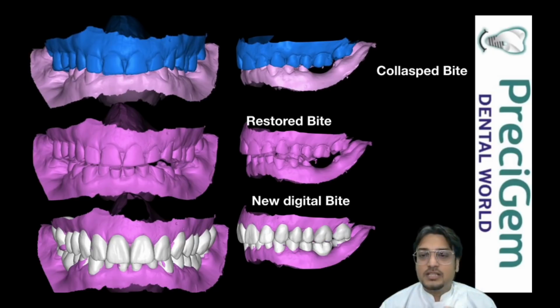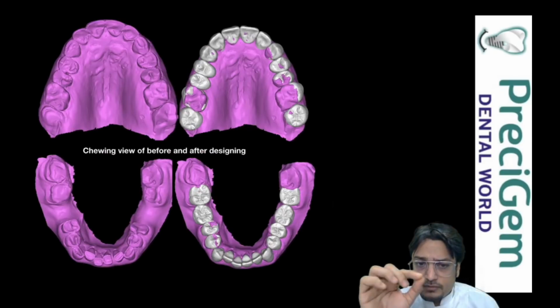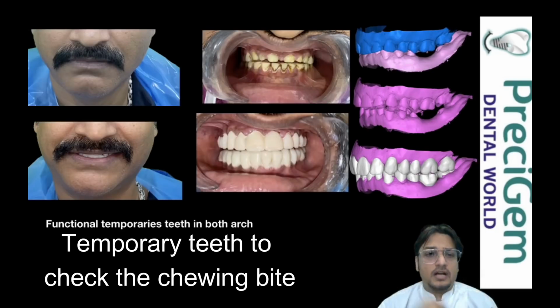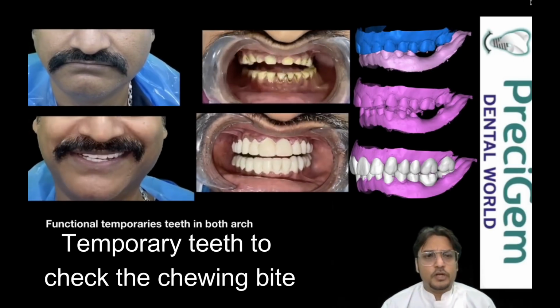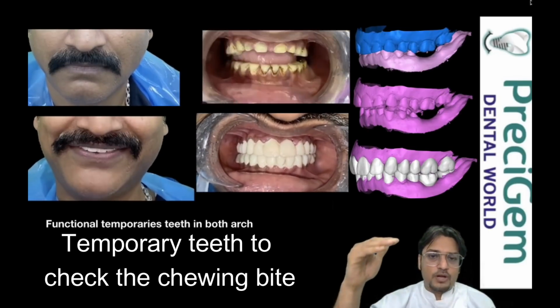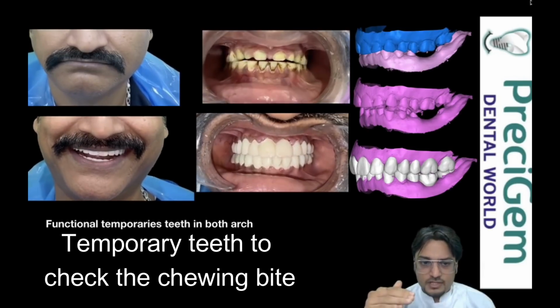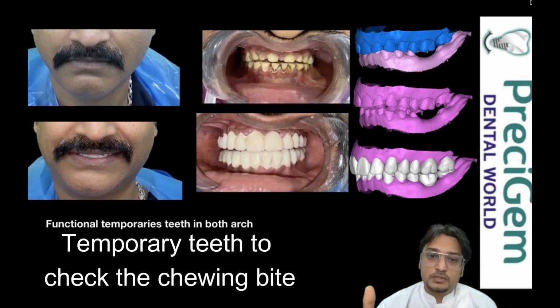Now this new digital bite is printed and then we transfer this new digital bite with the help of temporaries. This is the occlusal, that is the chewing surface. With the help of these temporaries, we transfer it into the patient's mouth. You can see this is one of the cases which is going on. If you see exactly, the upper one is the before and the lower one is the after. This functional temporary still needs some corrections which are going to happen.